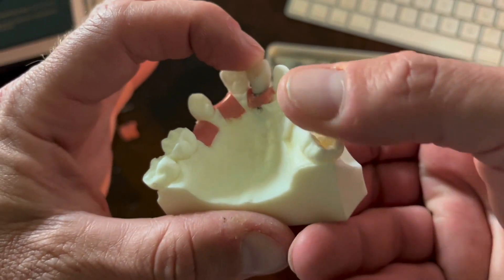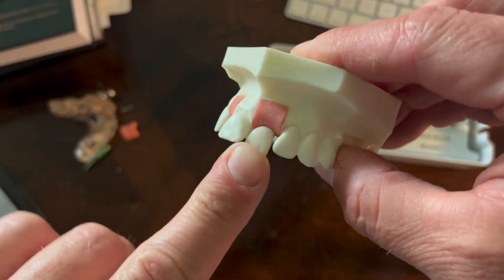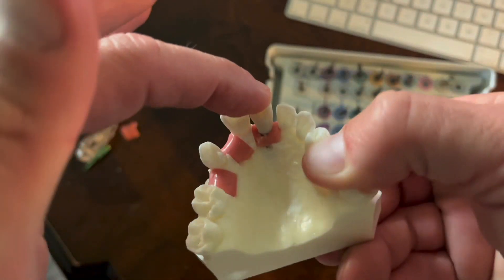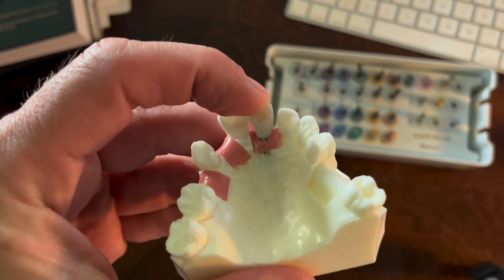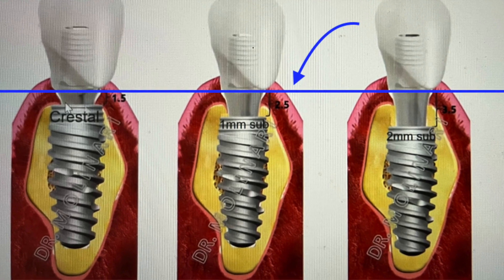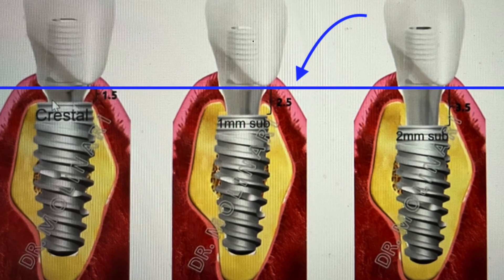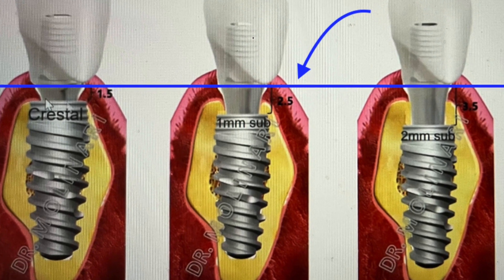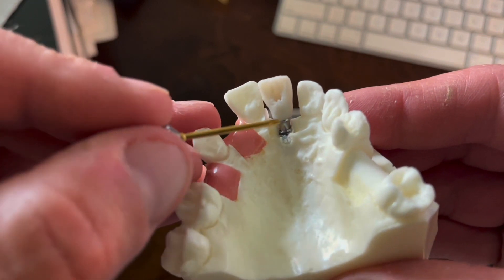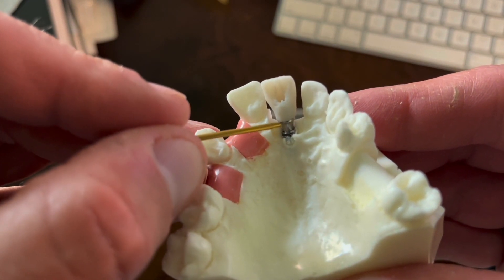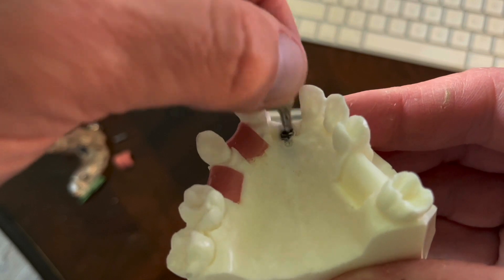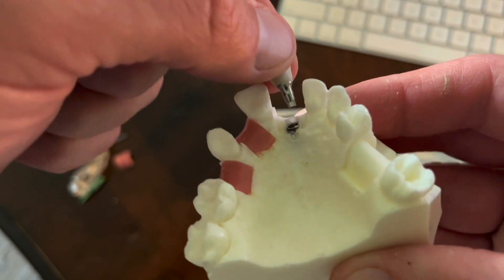When we get back to looking at a restoration, in this instance we have a temporary placed through the tissue. Notice that everything here looks exactly the same from the top down — look at this line straight across, everything looks the same. But if we get back in and look underneath, we can see that our implant is placed sub-crestally.